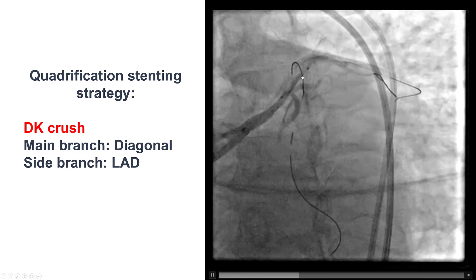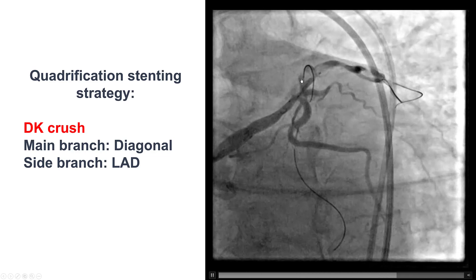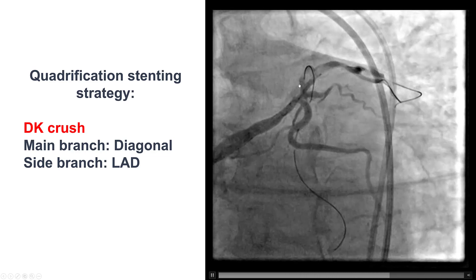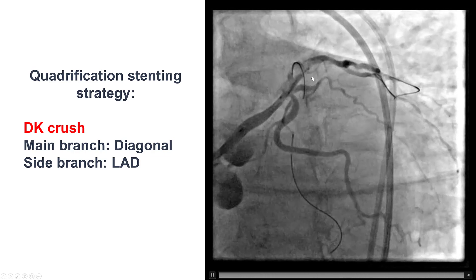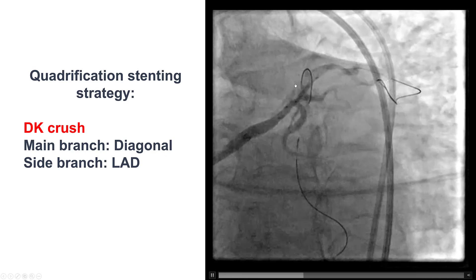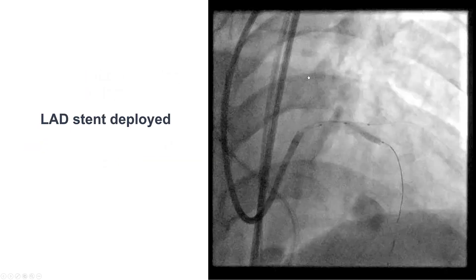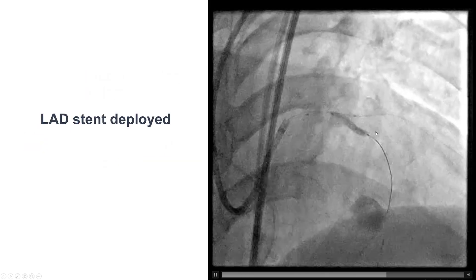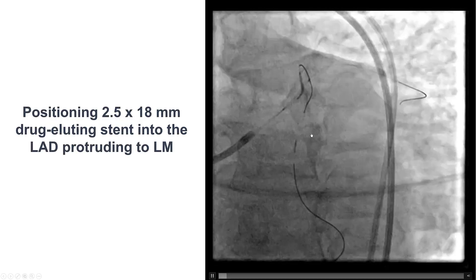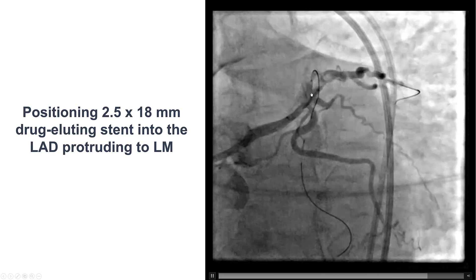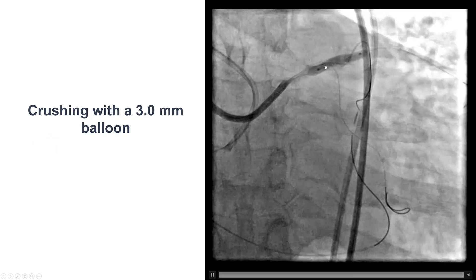We decided to treat this using the double kissing crush stenting strategy — the DK crush — into the two branches that were diseased, namely the diagonal which was considered the main vessel and the LAD which we decided to make the side branch. We deployed the stent first into the left anterior descending artery, protruding further back, and then we crushed it with a 3.0 mm balloon.